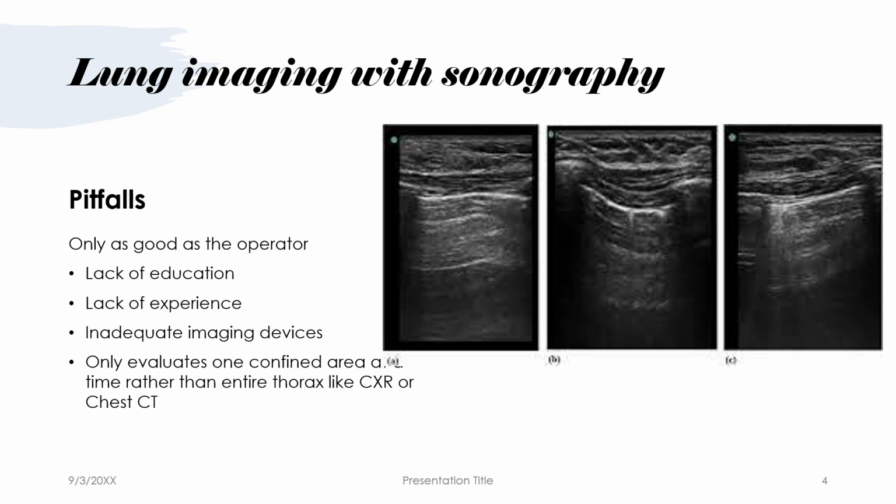One other thing, like I mentioned slightly earlier, is that these can give you the answer, but they're not necessarily going to give you the same sort of detailed information that you're used to getting with a CT exam of the chest or even a chest x-ray. And so you have to keep that in perspective, but the time it takes, the dose it saves, and just being able to provide that patient with immediate care can sometimes offset what you feel like you're losing by moving toward this type of exam or adding it as an option.